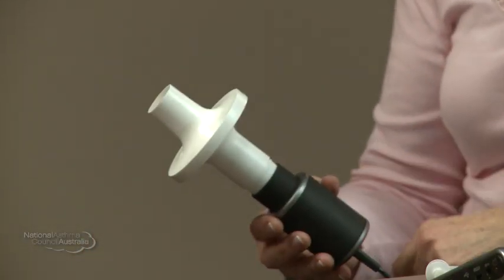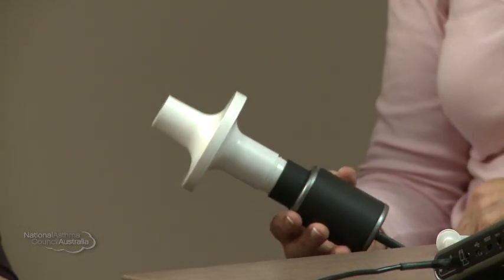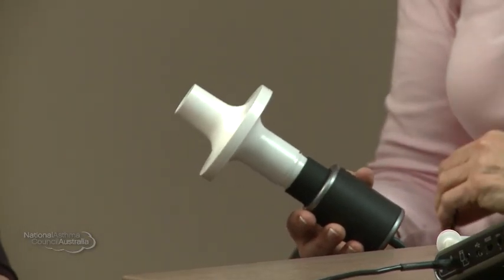To do the test, sometimes it can make you feel a bit dizzy or lightheaded, so we'll be doing it sitting down in the chair with your back nice and straight and your feet flat on the ground. We'll also be using a nose peg on your nose, and that will just ensure that all the air is coming out through your mouth to be measured. To hold this mouthpiece, when you place it in your mouth, you put the teeth and the lips over the end — a good firm seal with your lips.